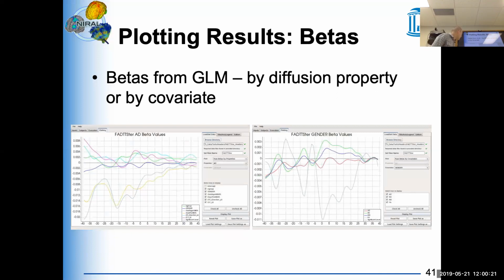So, for example, this green group, whatever the group is here, AD is positively associated with that group, whereas something like days since birth is negatively associated. Meaning that the longer it's been since birth, the lower the AD values. That's the negative association.